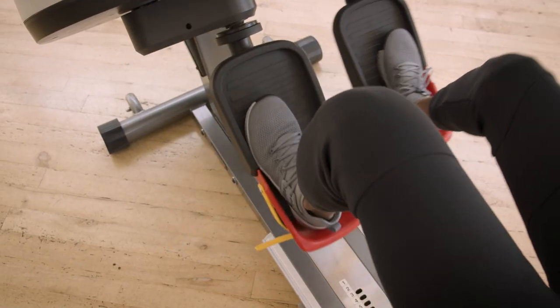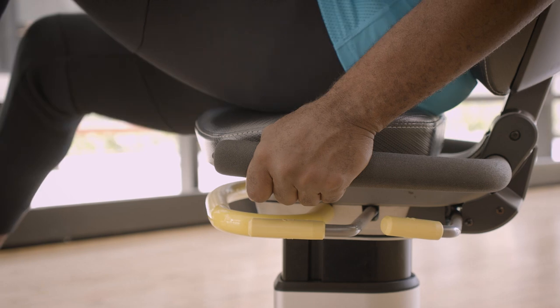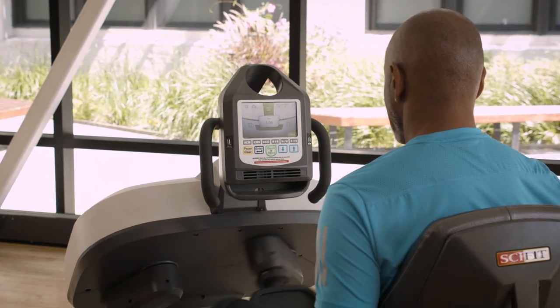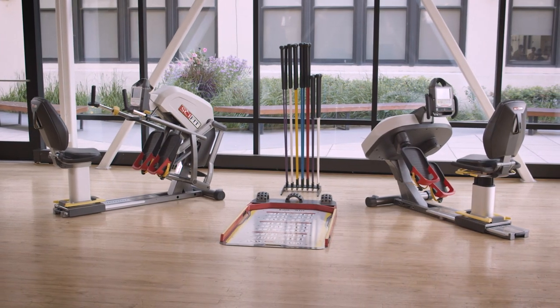The unique inward and outward circular motion of the Latitude strengthens the stabilization muscles necessary to reduce the risk of falls and build confidence walking. Being the first recumbent lateral stability trainer on the market makes Latitude a groundbreaking machine in the fall risk reduction portfolio.